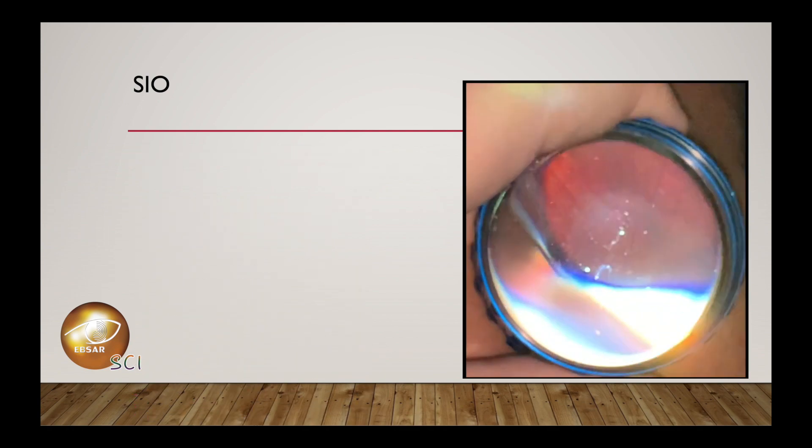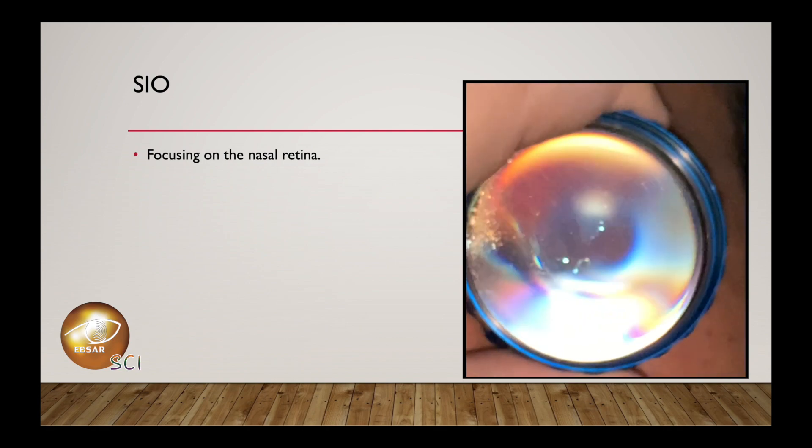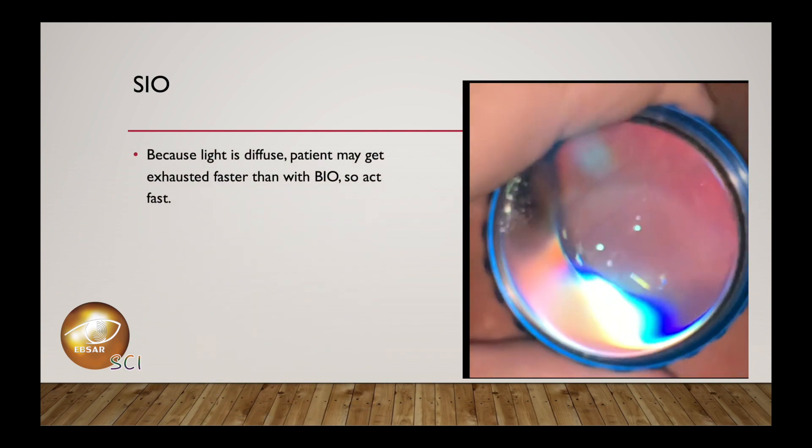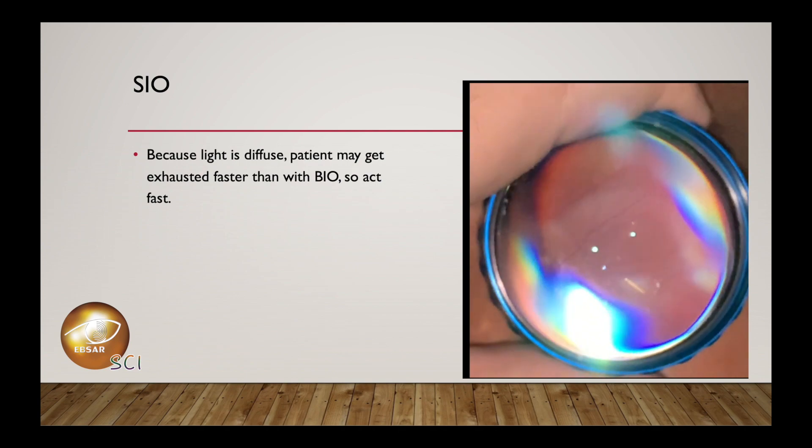Now focusing on the nasal retina - you see how easy it is. Because light is diffused, the patient may get exhausted faster than with binocular indirect ophthalmoscopy, so try to act as fast as possible.